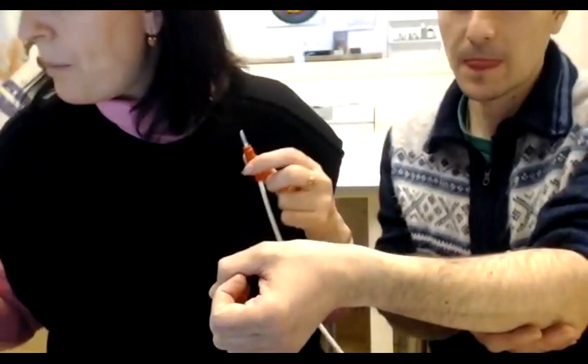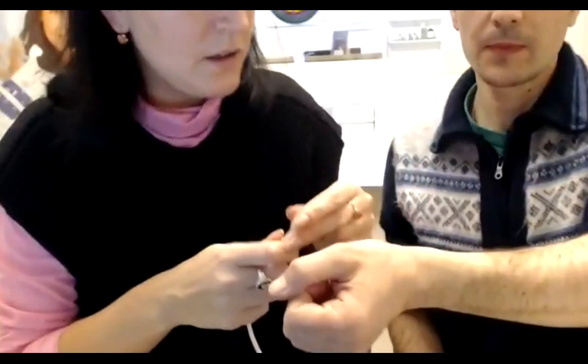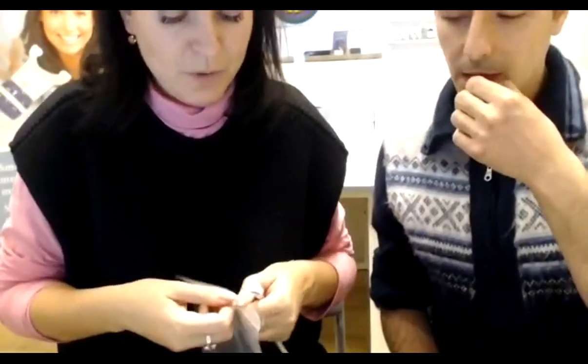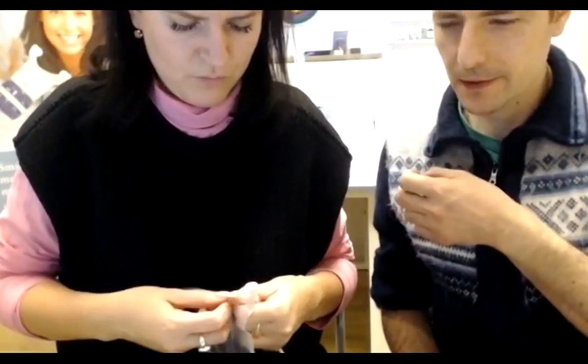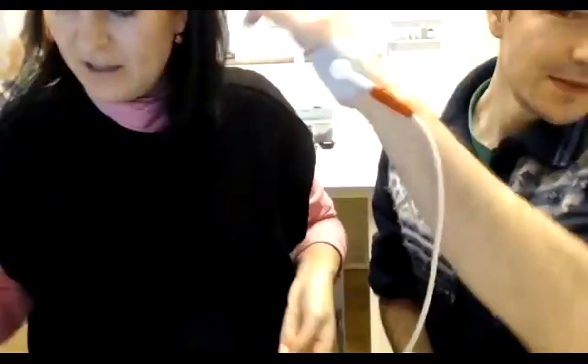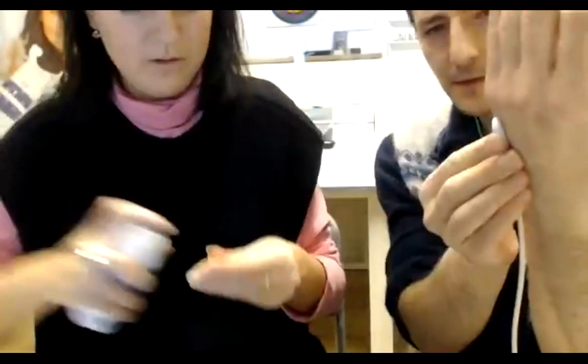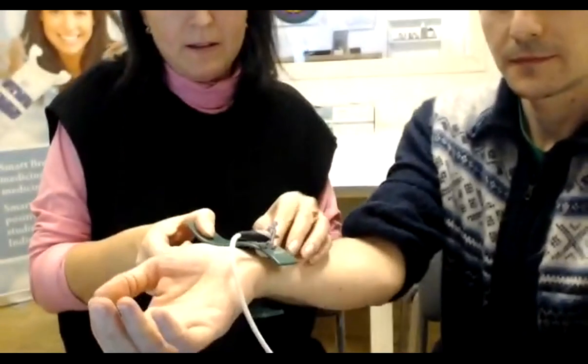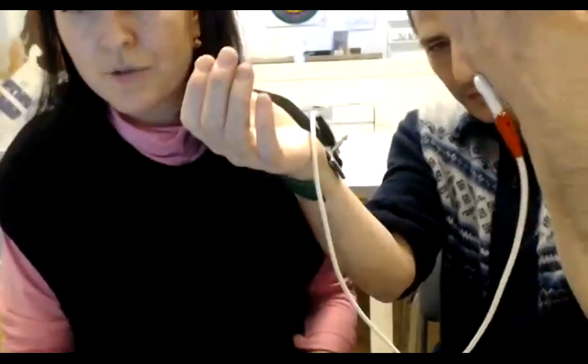So you take away this one. We will do the proper correction. So I'll show you, where is this one? Yeah, here. I'll show you how it should be. Then you can see these results when it's measuring you all the time. So wait, put this one, sticky electrode. This was your point. Yeah, right there. This one, and the other hand is going to connect like before. So he is connected to do treatment.